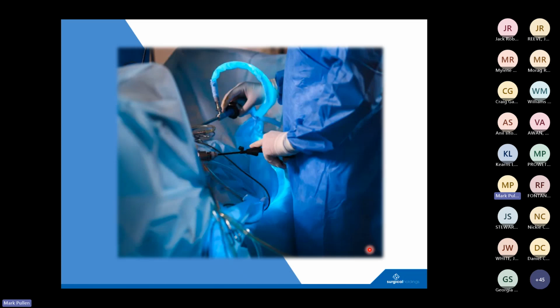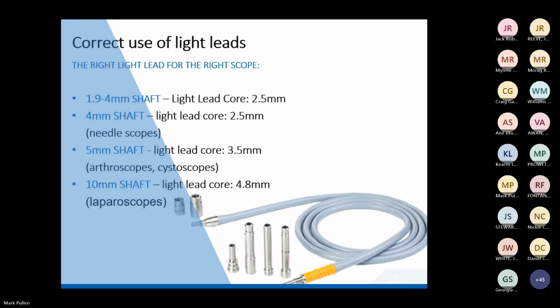As I mentioned, it's definitely worth checking your light leads and your light sources to make sure they are not failing. There are correct light leads that should be used with correct scopes. There's a quick breakdown there. You can cause internal damage to the fibers or adhesives. If you were to put a 4.8mm light lead onto a tiny hysteroscope and whack the light through it, you're going to burn those fibers out. Obviously, it's not going to happen instantly, but over time, that will cause ongoing damage.